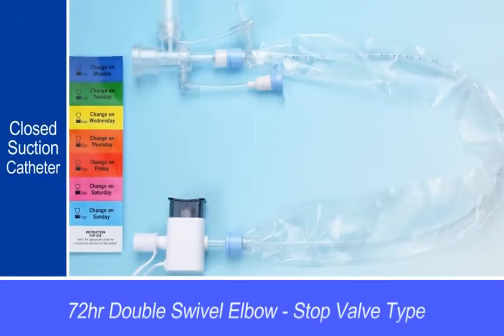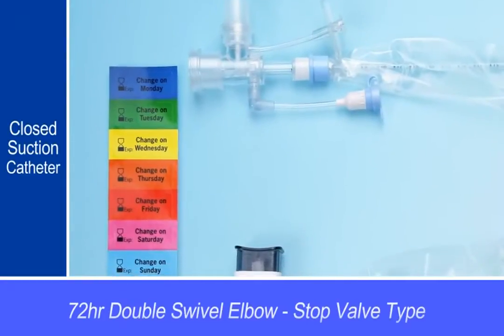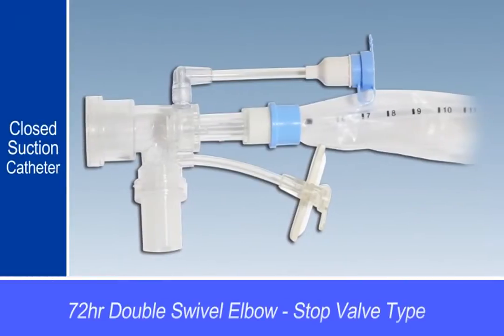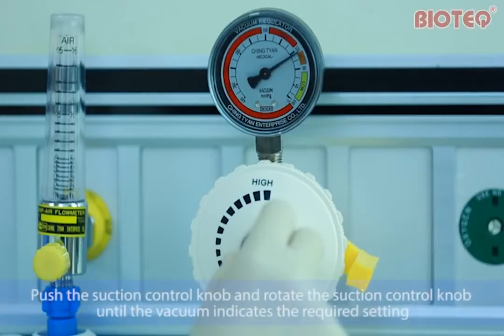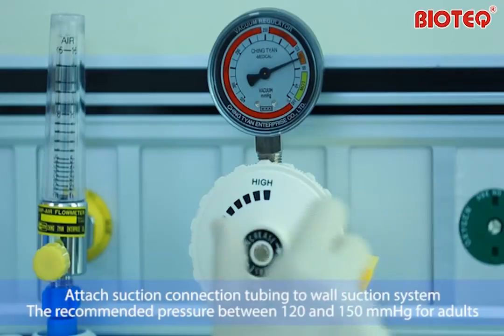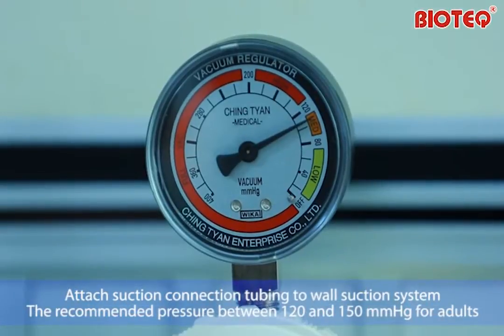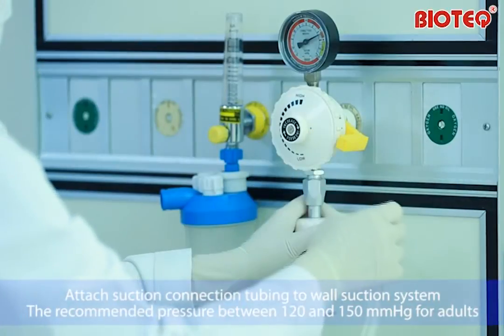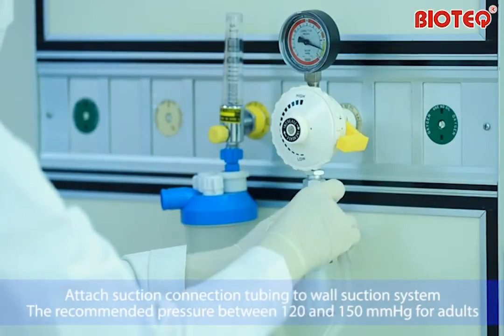Closed Suction Catheter, 72-hour stop valve type, double swivel elbow. Push the suction control knob and rotate it until the vacuum indicates the required setting. Attach suction connection tubing to the wall suction system. The recommended pressure is between 120 and 150 millimeters of mercury for adults.